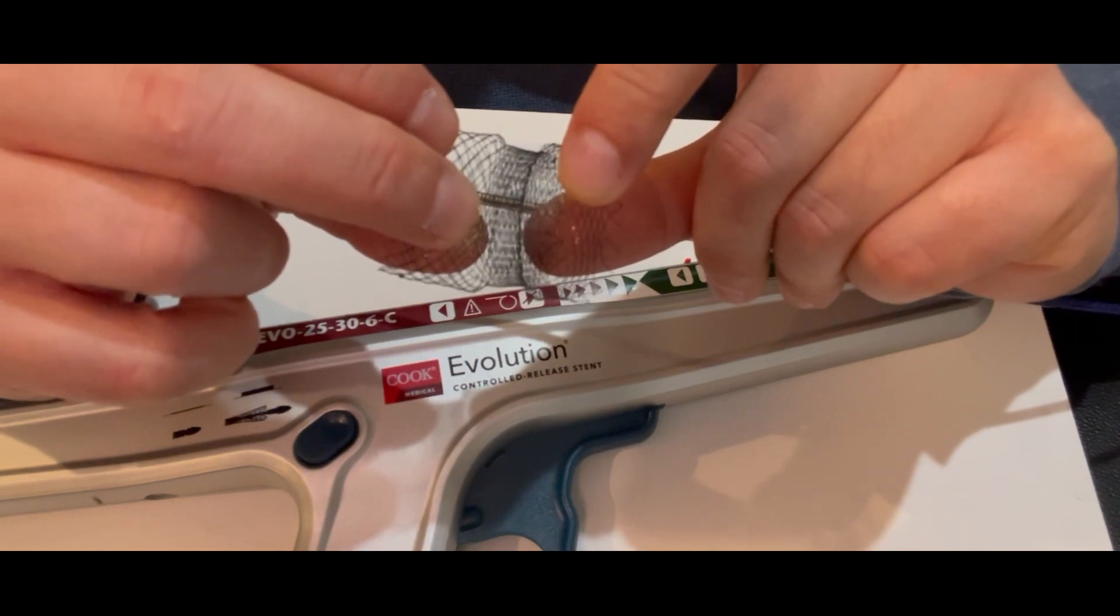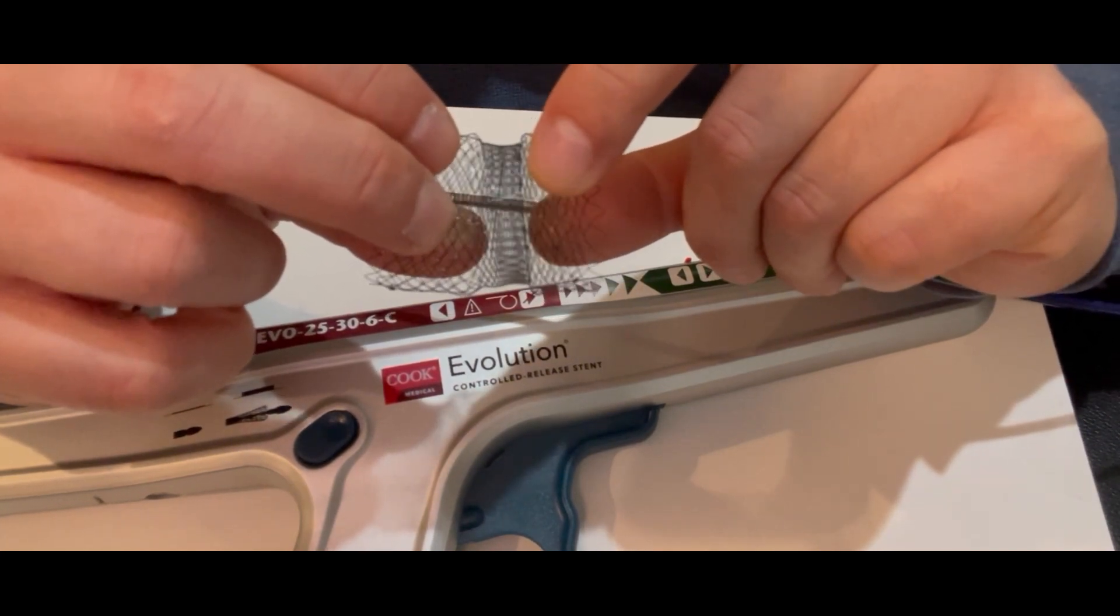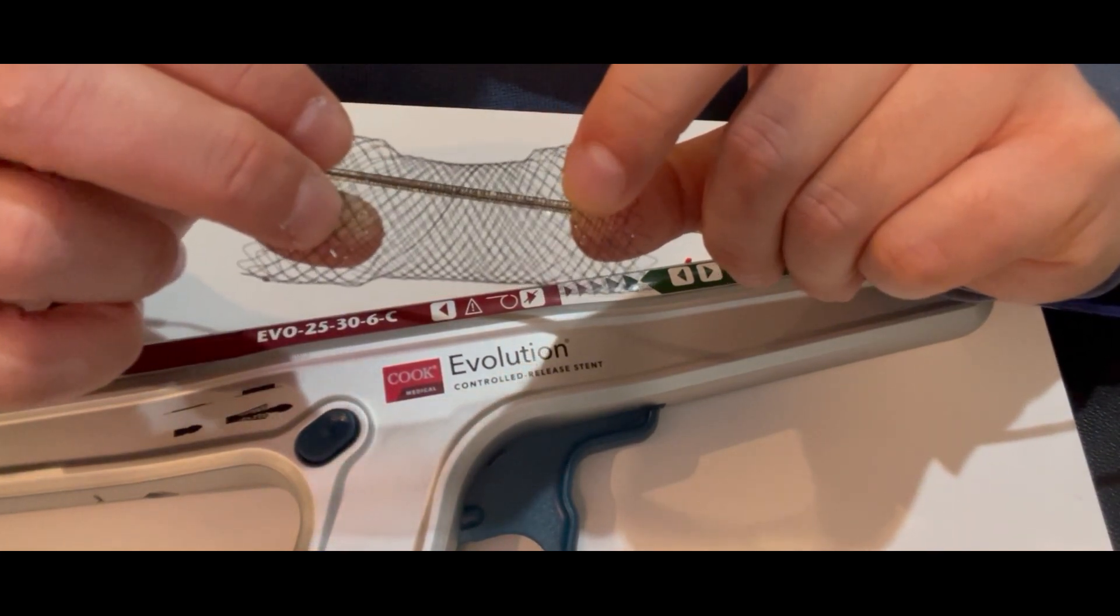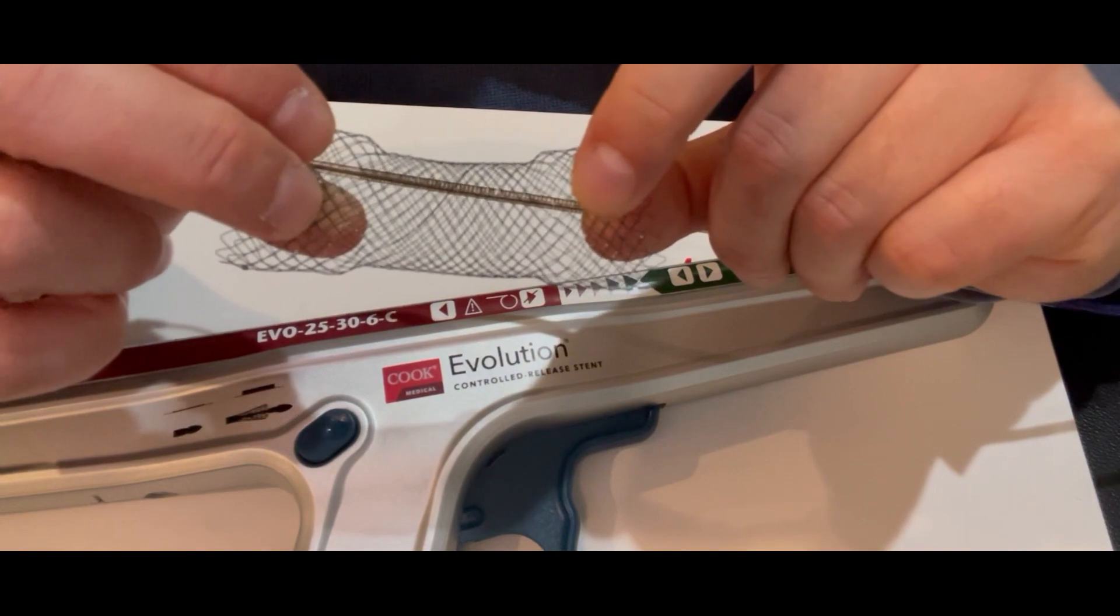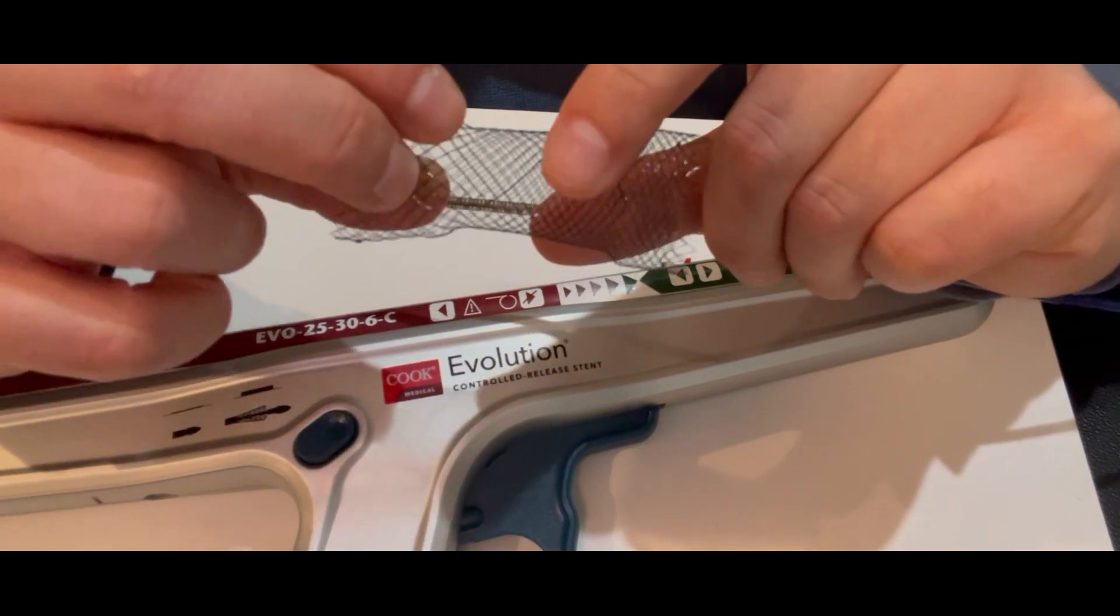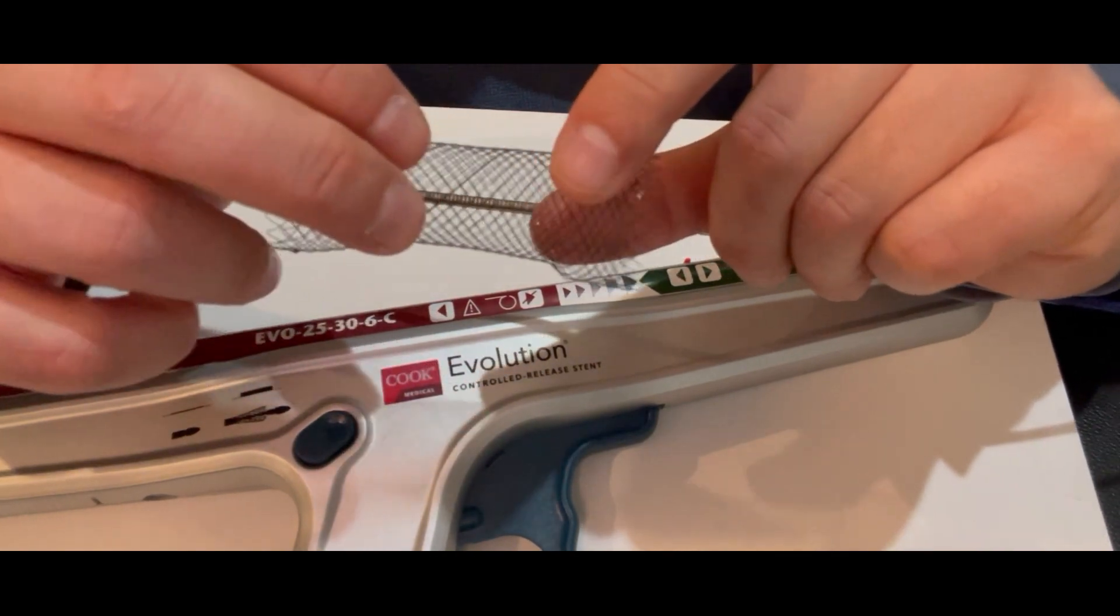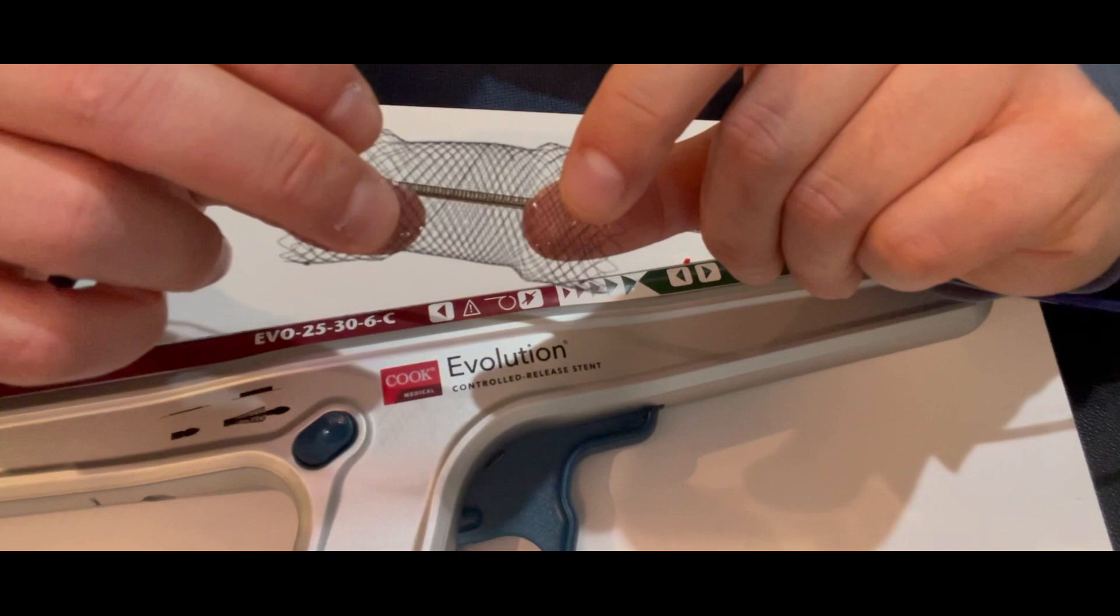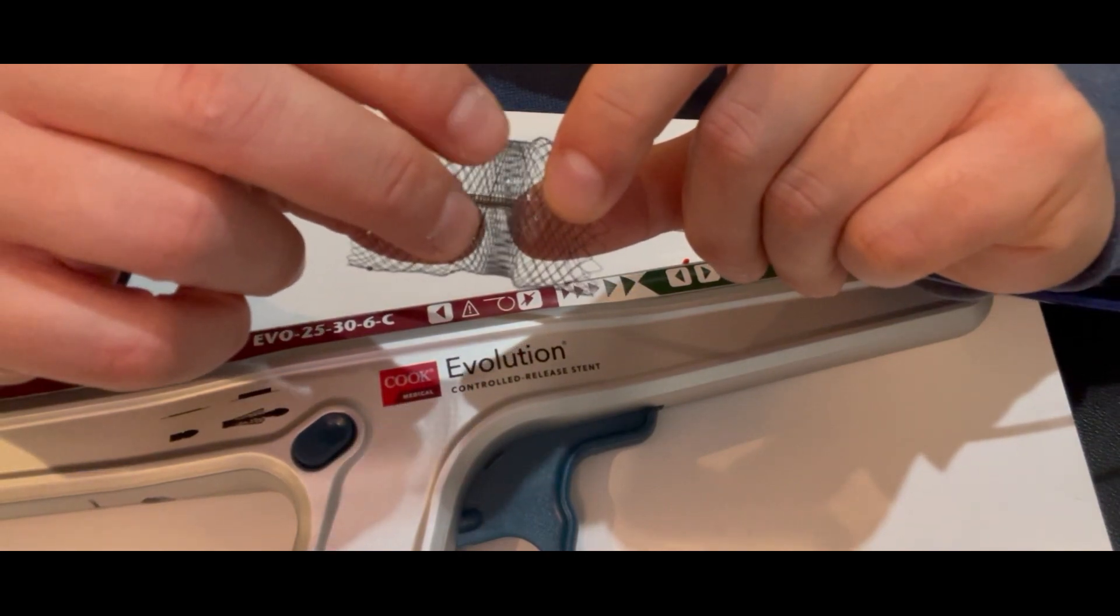So this is how the stent is deployed in a stacked fashion. And this is how it can be deployed as the operator sees appropriate for the anatomy.